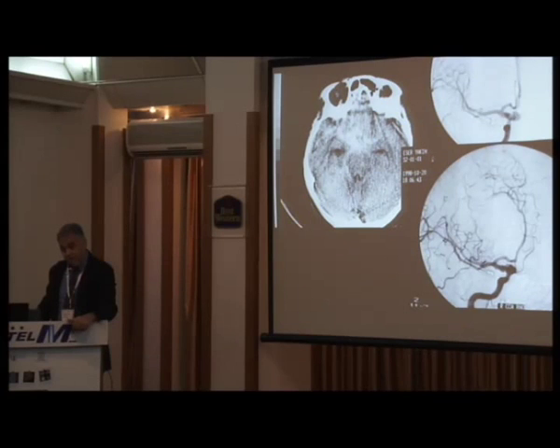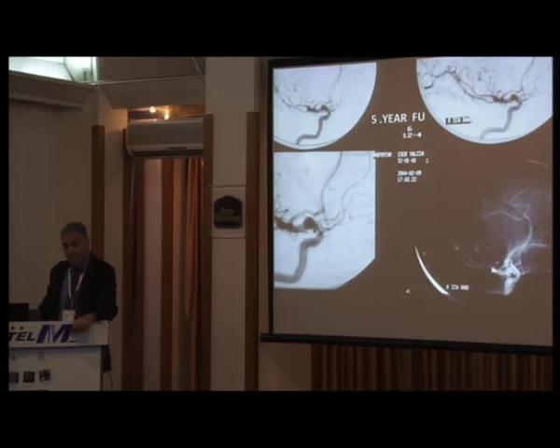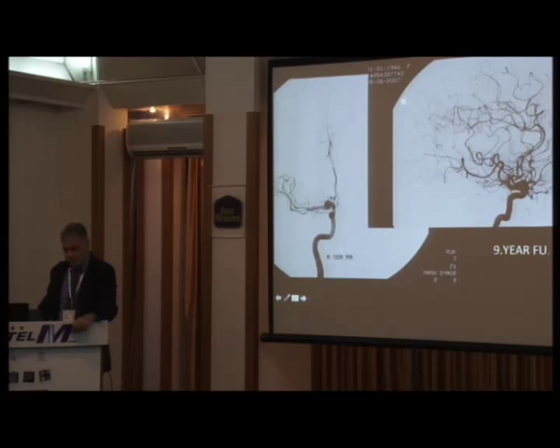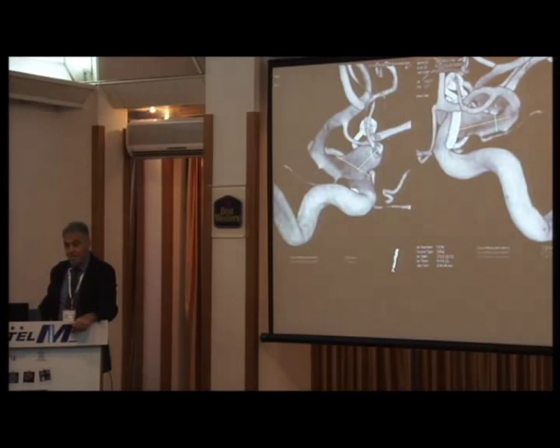It is happening with all treatment options. This ruptured case is an old one, from 1998. The surgeon wanted to clip it, and they did a good operation, clipped and wrapped. No aneurysm at all. Everything looks normal. This is the 5 year follow-up. Something is happening there, enlargement. This is the 9 year follow-up. Again, it's enlarging. At 14 years, the patient started to have symptoms because of the enlargement of that fusiform segment, which turned out to be a saccular aneurysm with a fusiform neck.